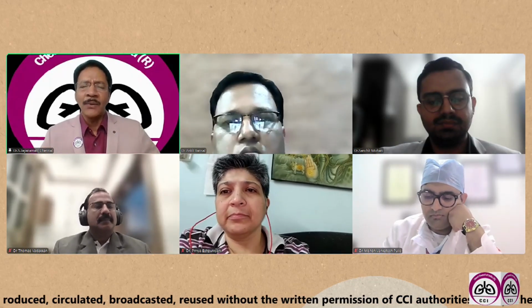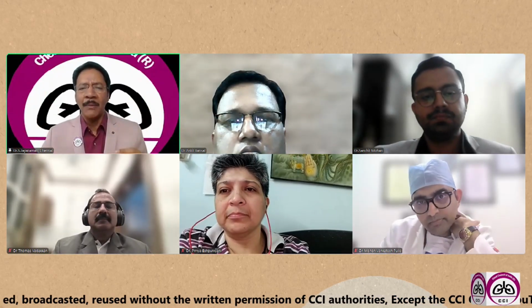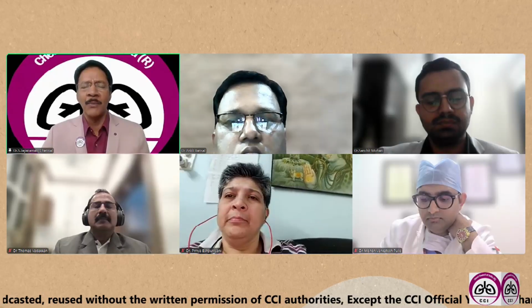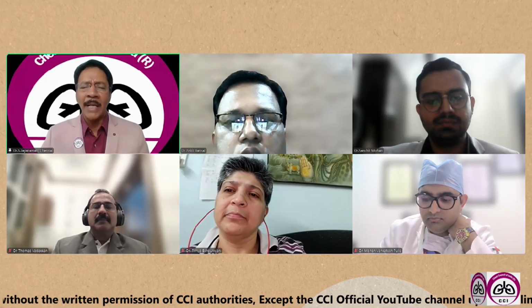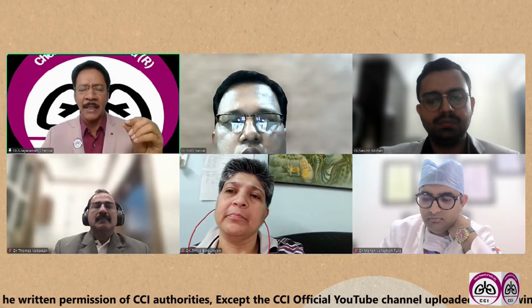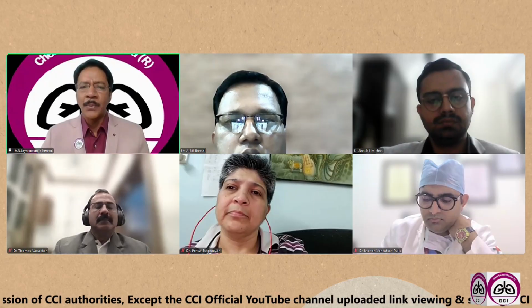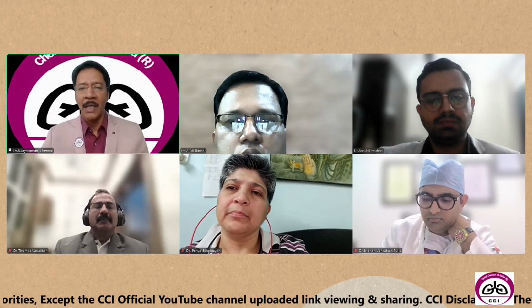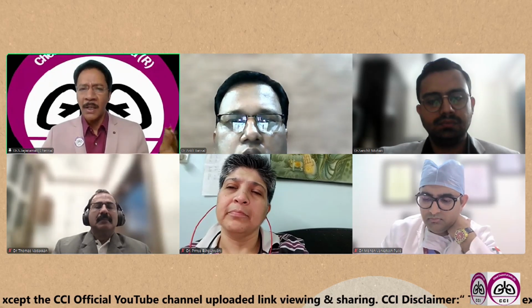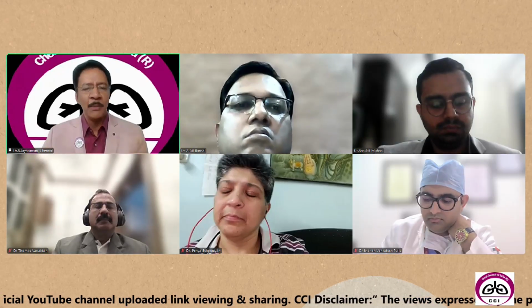Previously, for any mediastinal or lung lesions, we relied mostly, and even nowadays still rely mostly, on CT-guided needle biopsy. There are a lot of complications with CT-guided needle biopsy. If centers don't have the facility for mediastinoscopy or endobronchial ultrasound, or a good interventional gastroenterology department using EUS, there are a lot of complications if you submit the patient for CT-guided biopsies: bleeding, pneumothorax, etc.